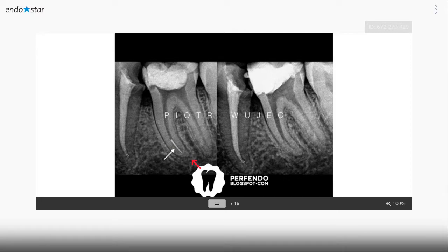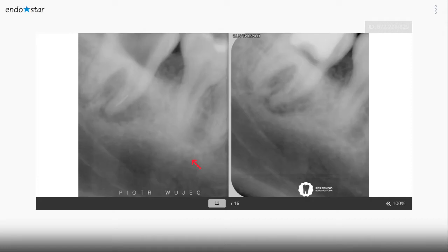And I said, okay. On the preoperative x-ray, it is in a very difficult area, but I will try to do this removal protocol. And it was not as difficult as I thought. After a few minutes, I had the file cemented inside the needle. This is one of my very first cases of this technique, I think 11 or 12 years ago, when I was trying to do this and learn this technique.